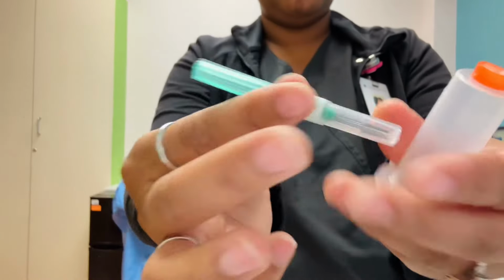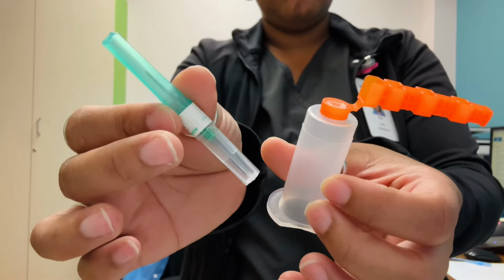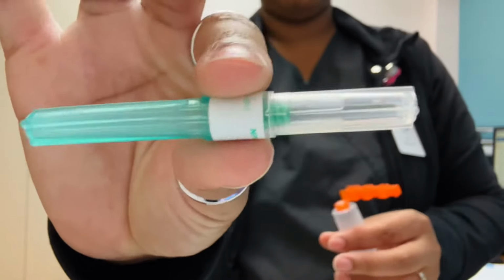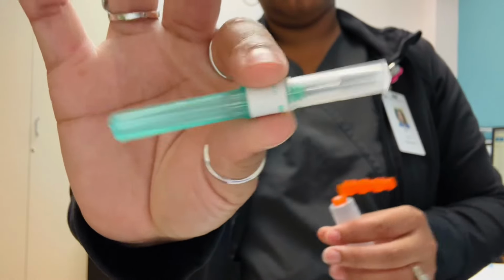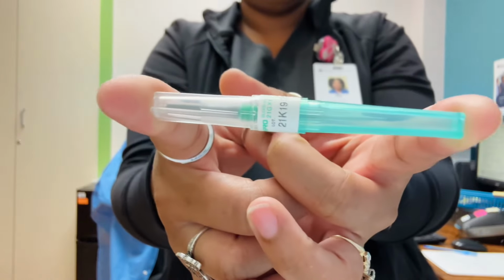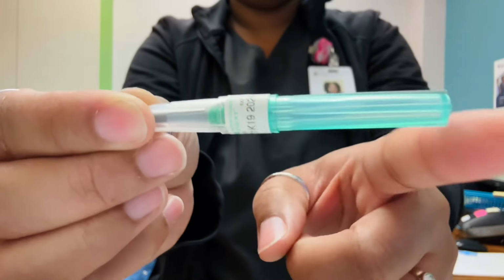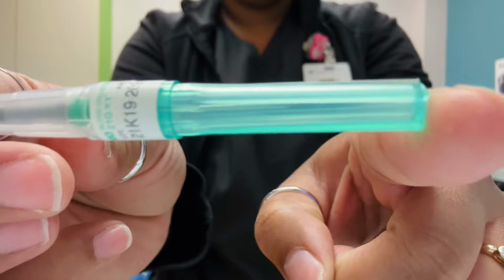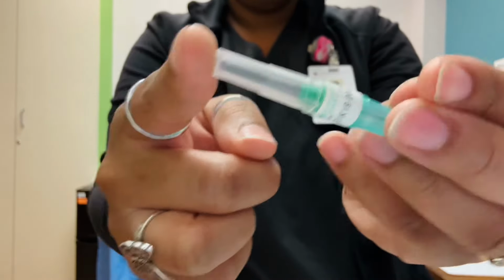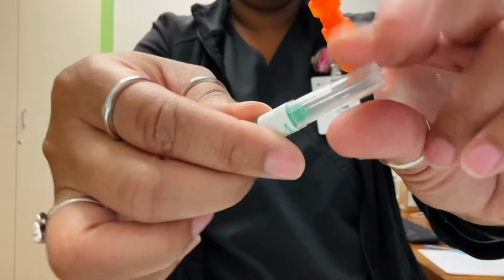Most butterflies have their own safety connected with the needle. So here I'm going to show you how to pair one of the needles that doesn't have the safety with a hubcap that has the safety. A blood draw needle normally comes with the needle on one side and then another needle on the other side that is covered by a rubber sleeve. So on your straights, on the color-coded side, you're going to see that that's where the needle is. And on the other side, that is where another needle is covered by a rubber sleeve. That is what you're going to place into your hubcap.